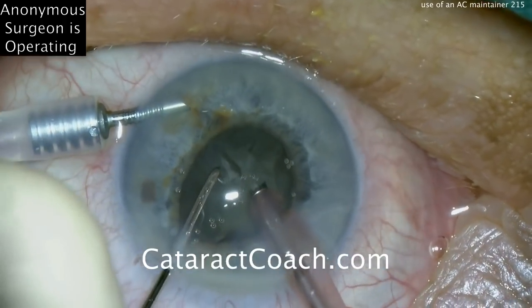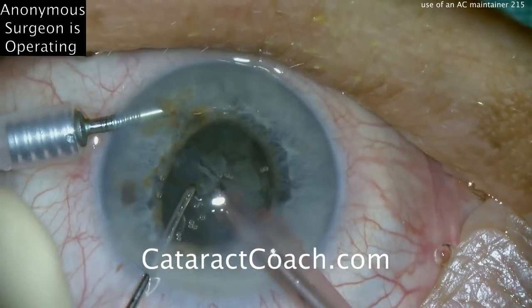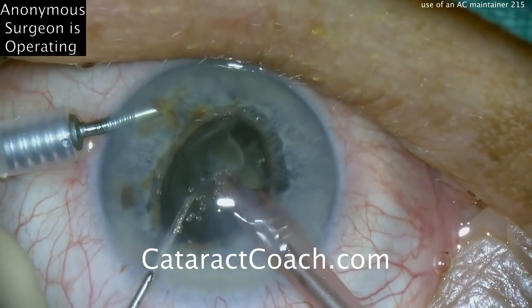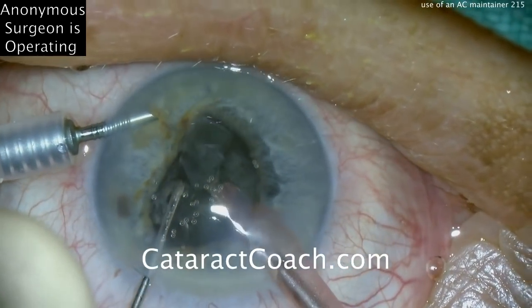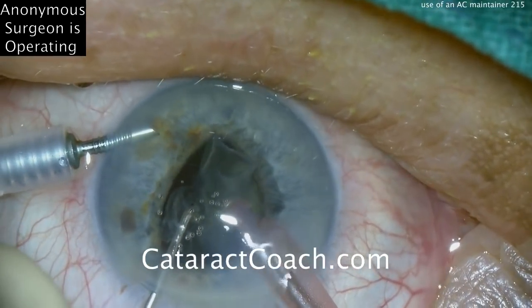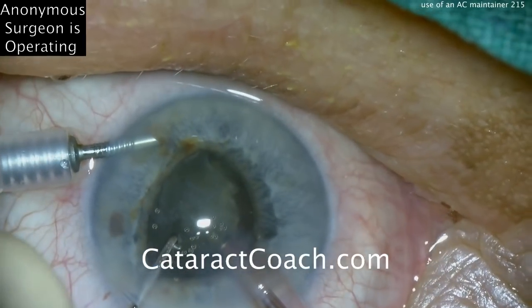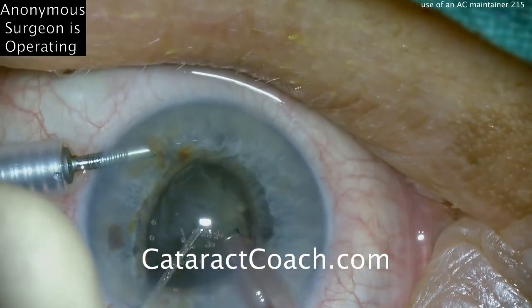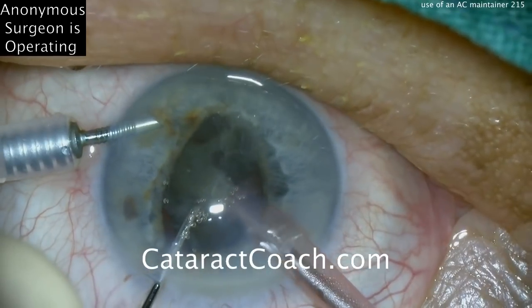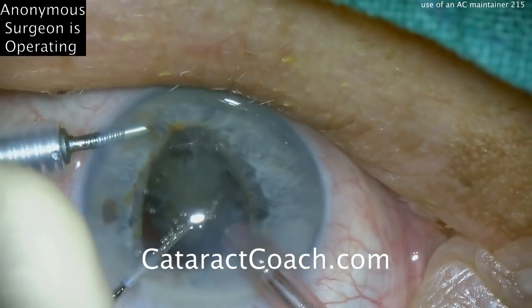Last couple of pieces here. At this point, not much more phaco chopping is needed — the chopper can just be used to push the piece in front of the probe, and we can aspirate it down with a little ultrasound power. One very helpful thing when you use an anterior chamber maintainer is there's no surge, because you have a lot of inflow. There are two sources of fluid inflow: from the phaco sleeve on the side ports, as well as the AC maintainer, and that balances any outflow very nicely. The outflow is leakage from the incision as the minor one, and flow down the barrel of the phaco needle as the major one.